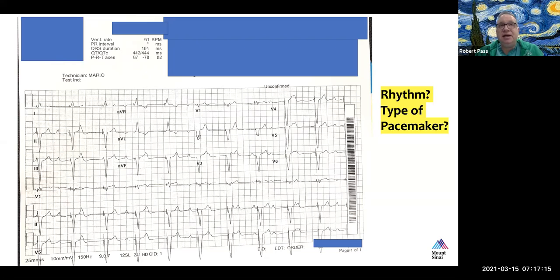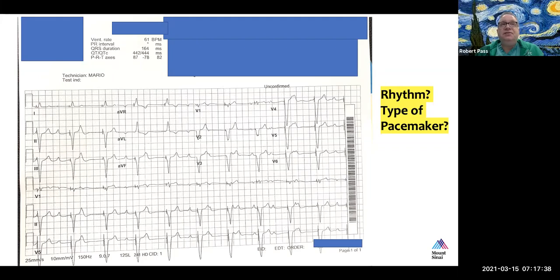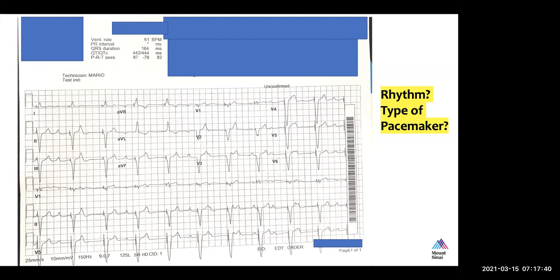So let's assume again, we have this transposition patient who is now post-op day 10 and has not recovered conduction. Dr. Murphy, our surgeon, has been asked to put the pacemaker in, and he asks you the question: single or dual chamber? I'm not sure. How would I make that decision? So what are the advantages of dual chamber? You can have AV synchrony.